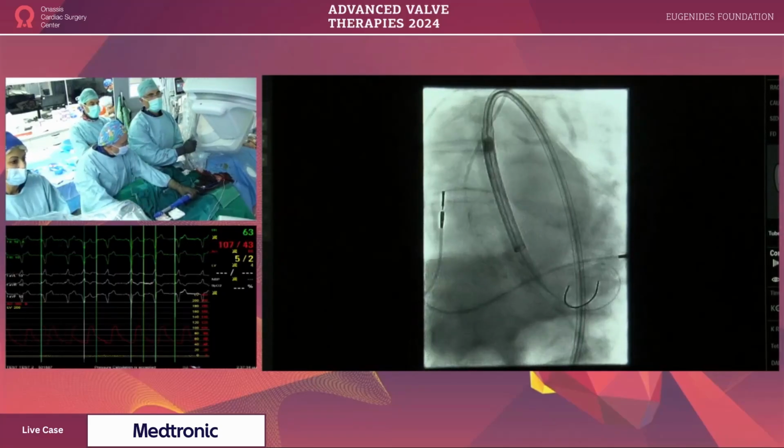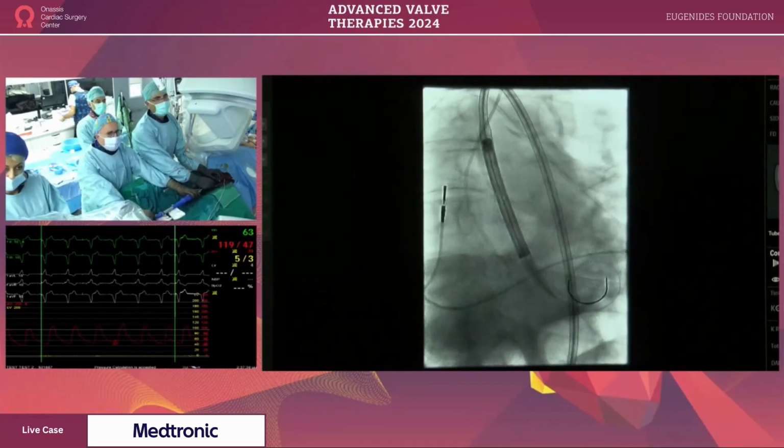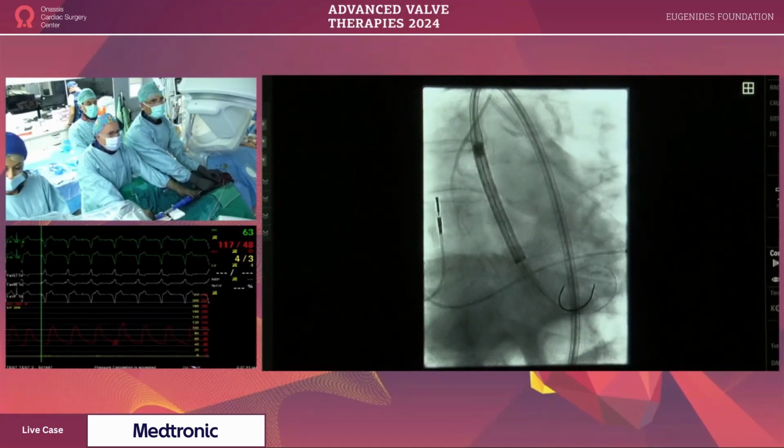I think maybe we're in a better position. Do you also use near cusp overlap views?